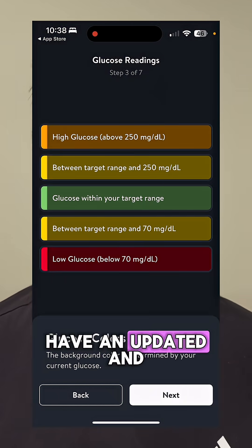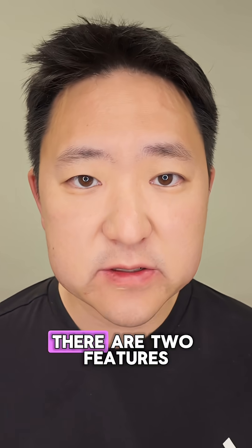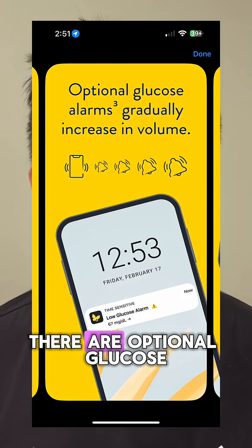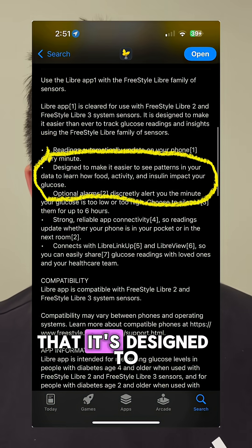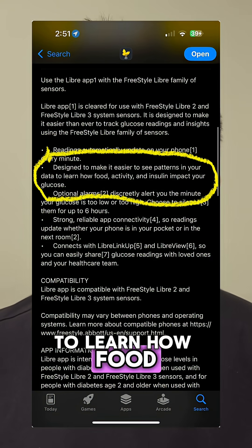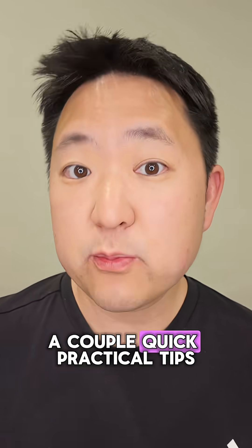Number 4, it does have an updated and more user-friendly interface. Now, from the App Store app description, there are two features that I couldn't really test out yet. First, it says there are optional glucose alarms that gradually increase in volume. Also, it says that it's designed to make it easier to see patterns in your data to learn how food, activity, and insulin impact your glucose.